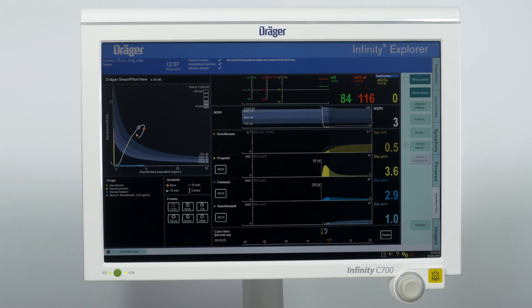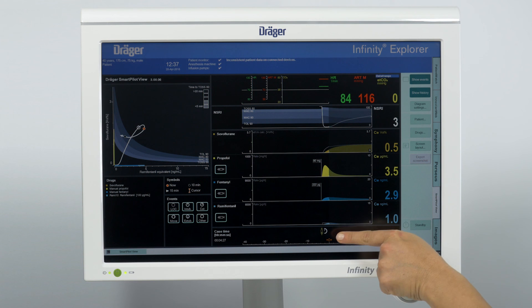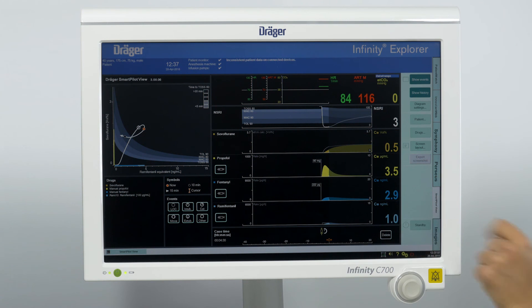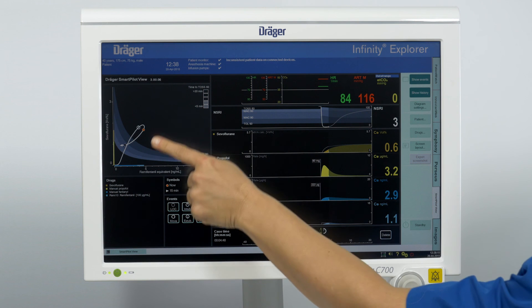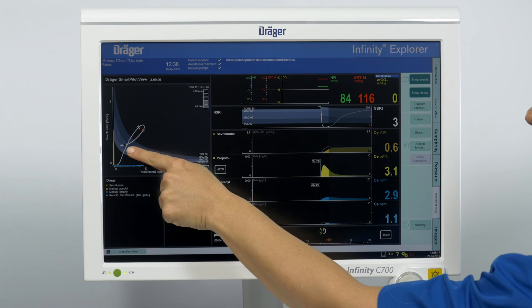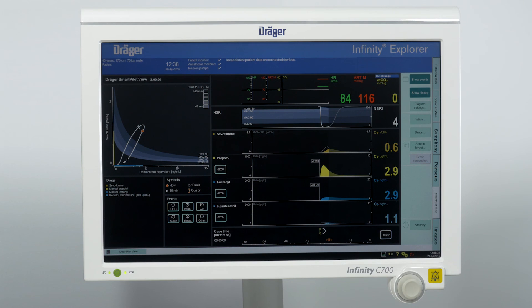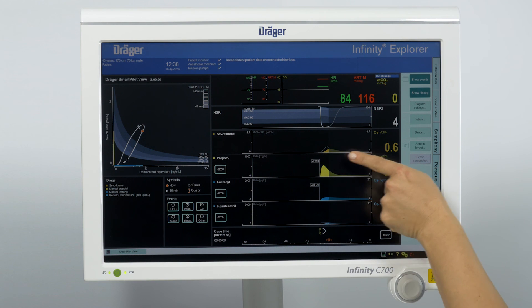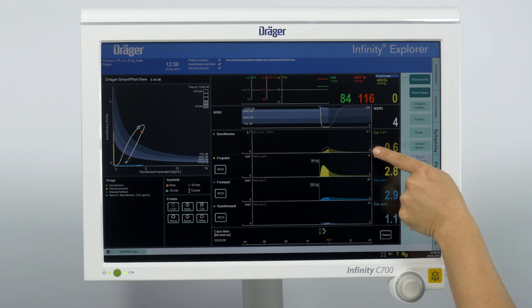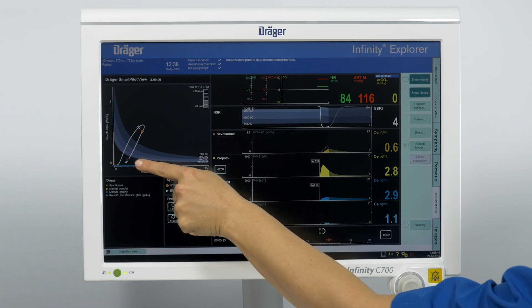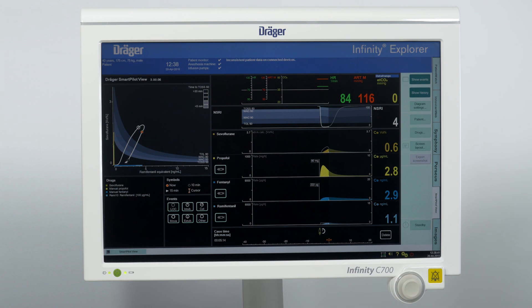Now we will stop the remifentanil infusion. The effect site concentration will decrease due to metabolism of the drug in the next 10 minutes, and the patient will remain in adequate anesthesia. Then we discontinue the sevoflurane dosing. You can see in the time-based display and the two-dimensional display the prediction that the patient will wake up in about 15 minutes and will have few opioids on board.